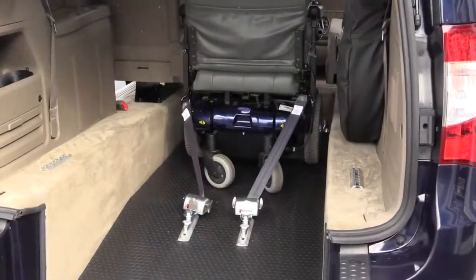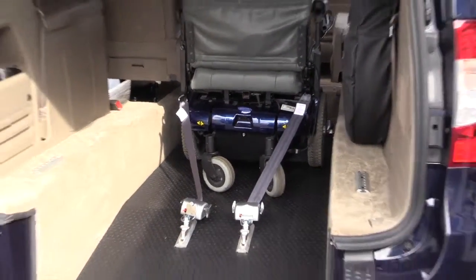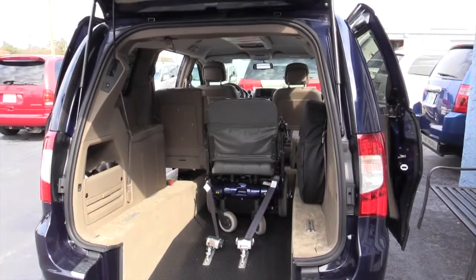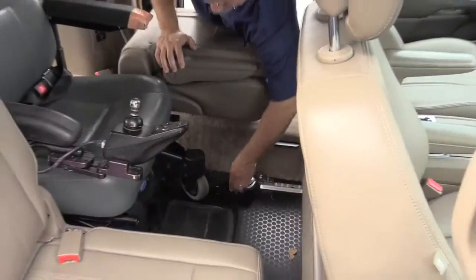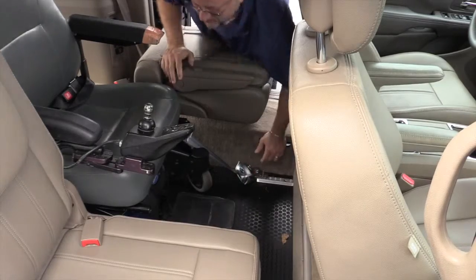Now your wheelchair is secured in the rear with two retractable tie-downs, so you can move to the front to secure the two in the front. The front retractors are easily connected to the wheelchair.